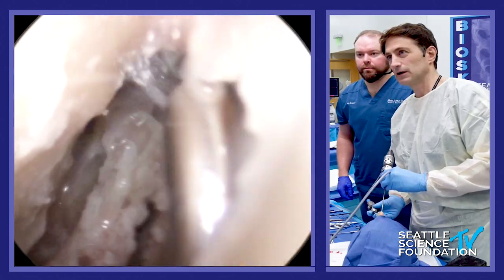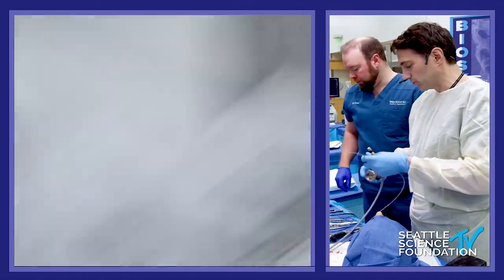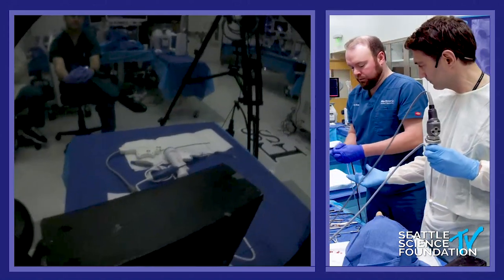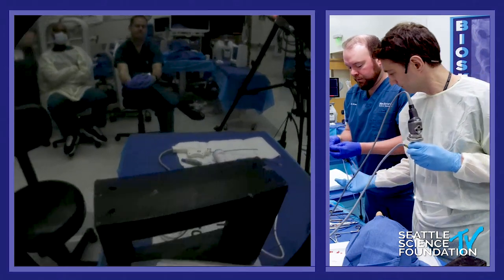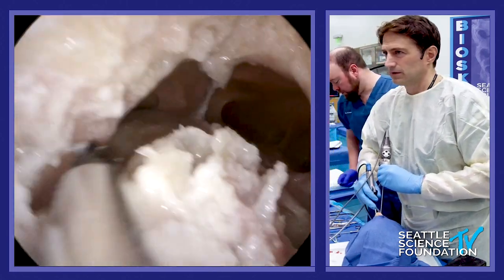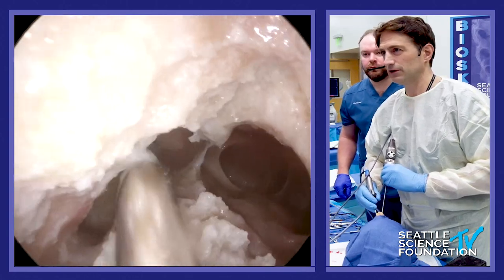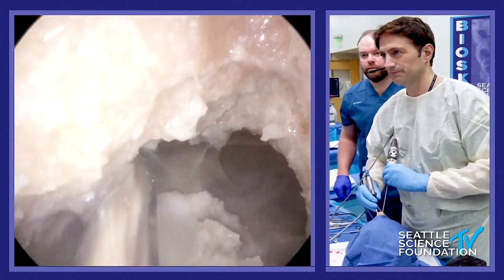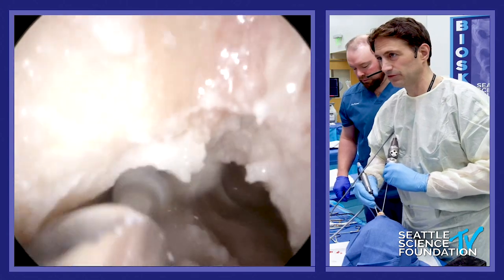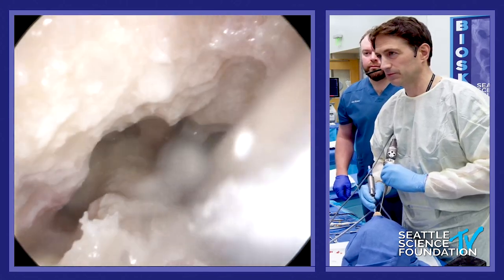Now I like to use the 70-degree scope — this is the last move I do — and round out the corners. Give me a 70-degree cutting burr. Now we're looking up; you can use both nostrils if you want. Bring this down just a little bit more there. I call this rounding out the corners — making sure you have a nice smooth transition here. Then I want to take this inner sinus septum all the way down.